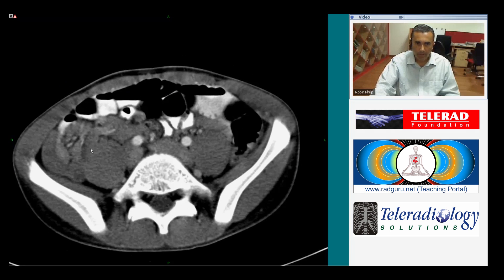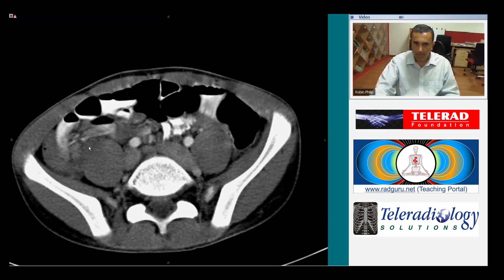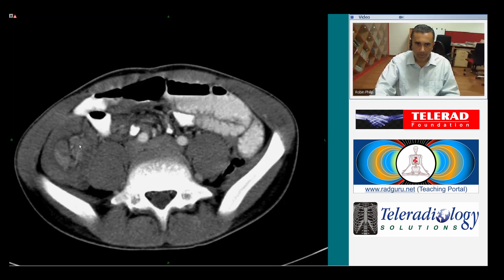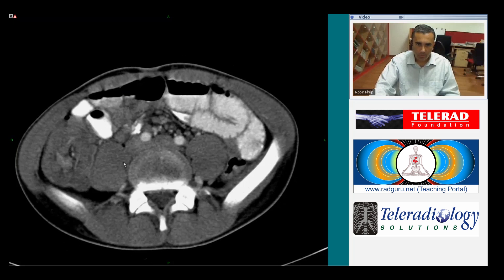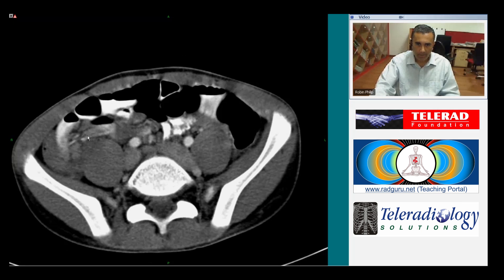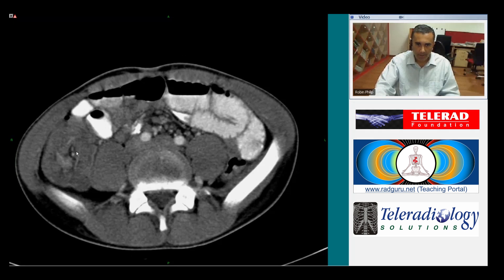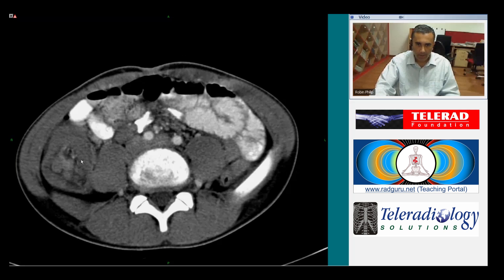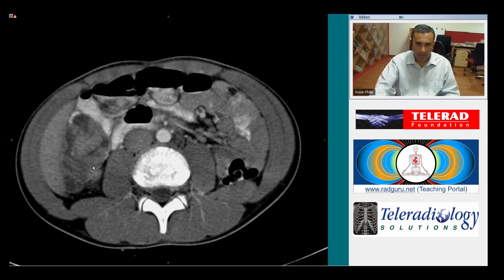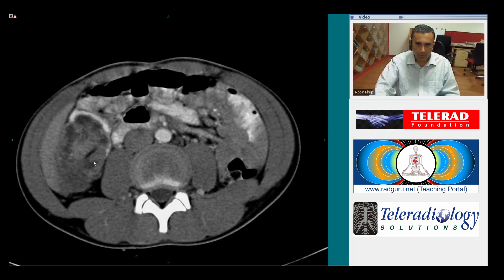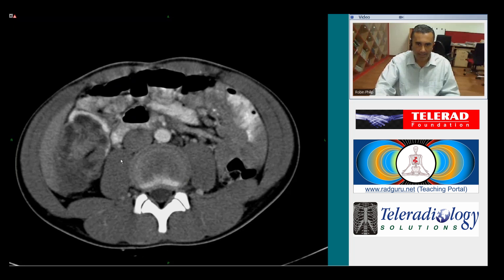Looking carefully, we see the unmistakable appearance of mesenteric fat within the bowel and mesenteric vessels within the ascending colon. As we follow it up, we see it terminating in a soft tissue polypoid mass at the level of the right flexure, which clearly has elements of fat in it.